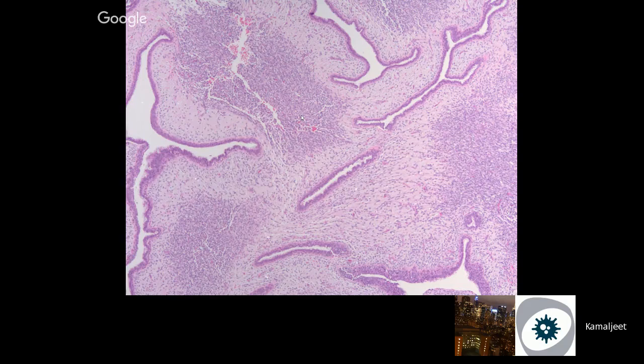So basically, if you're looking at a phyllodes and you're thinking of a low-grade sarcoma, if the stroma looks like a low-grade or high-grade sarcoma, you're into this malignant sort of category, borderline or malignant. One other thing that is in the footnote in the table is that if you have a liposarcoma, rhabdomyosarcoma, a heterologous element, it's a malignant phyllodes, no matter what the mitoses and everything else is.